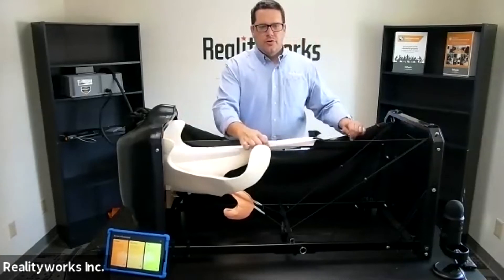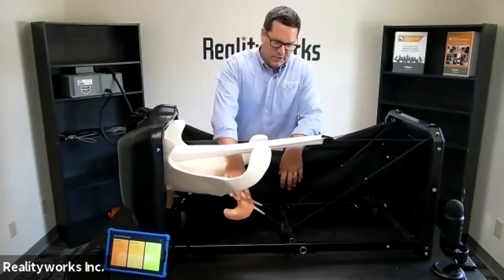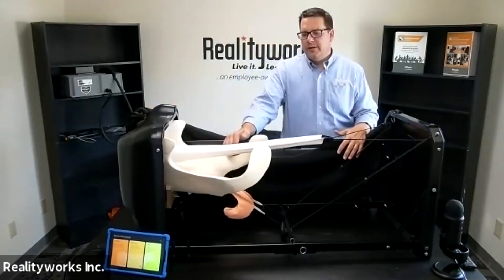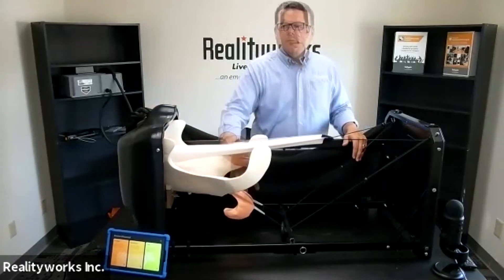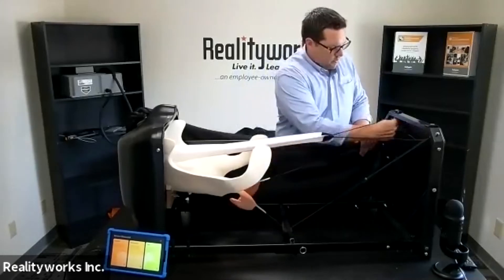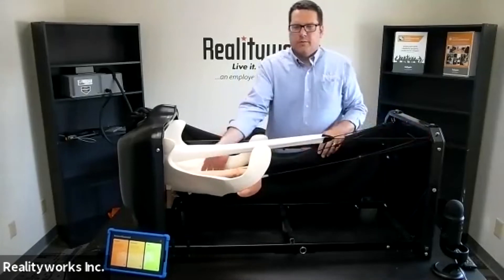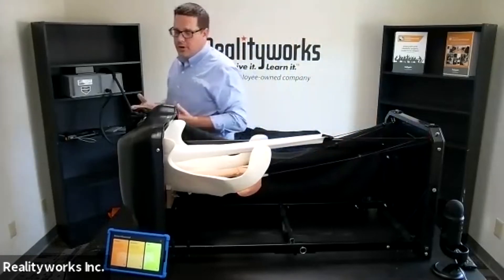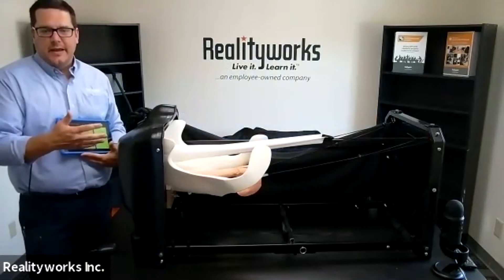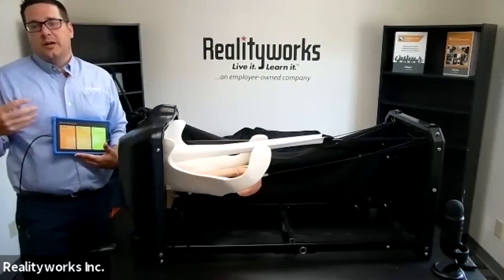Below the digestive tract is our reproductive tract, which I have set up in the lower position. Older animals will often have their reproductive tract lower or sagging, so that's represented here. I can switch it by moving the cords, bringing it up higher for a younger cow. The whole focus of our ultrasound component is learning what is going on inside the animal while it is pregnant — checking before pregnancy, when it becomes pregnant, and all those different features.